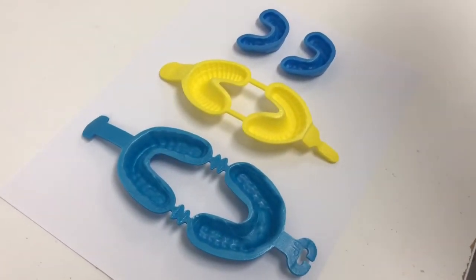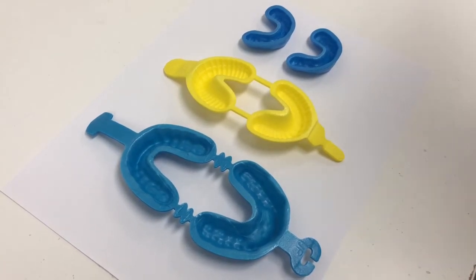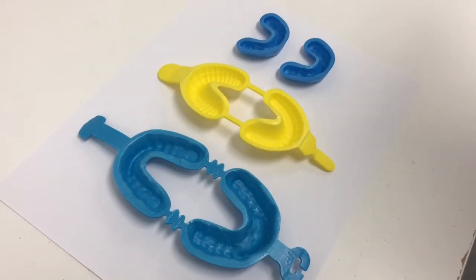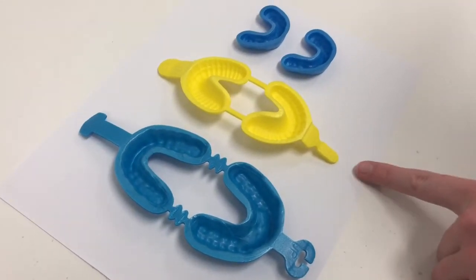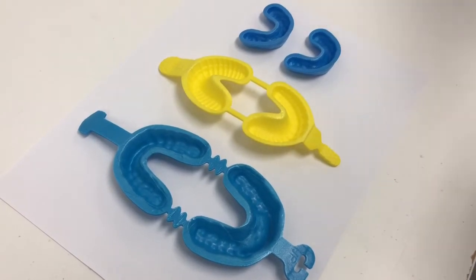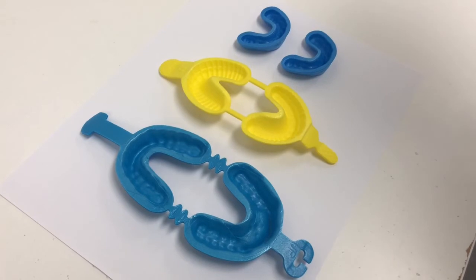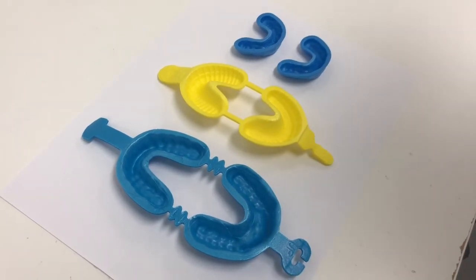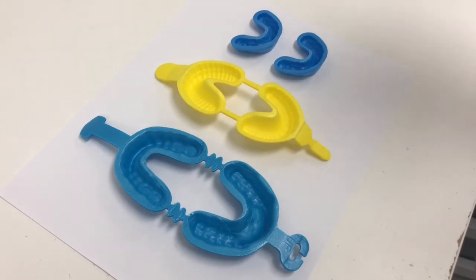Here we have three different sizes of our fluoride trays. You'll want to select the appropriate tray depending on your patient — here we have trays for full dentition, mixed, and early dentition. Next, you'll want to shake the fluoride gel in the bottle and then make sure to fill it up about a fourth to a third full of the fluoride gel.